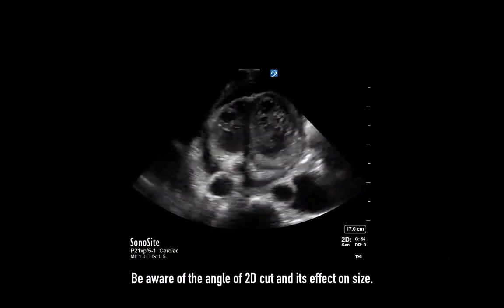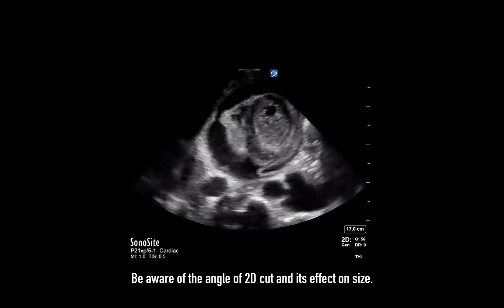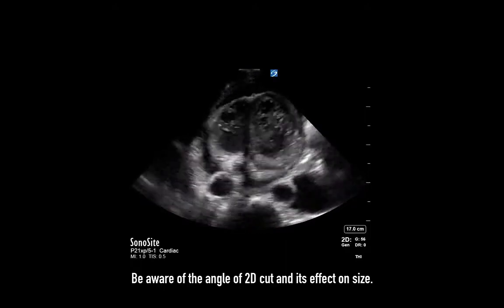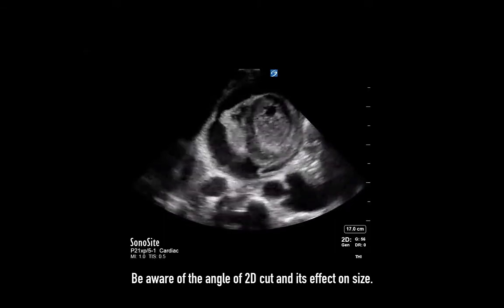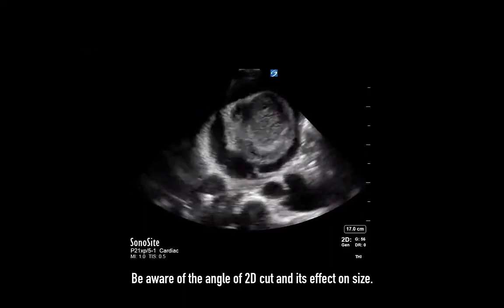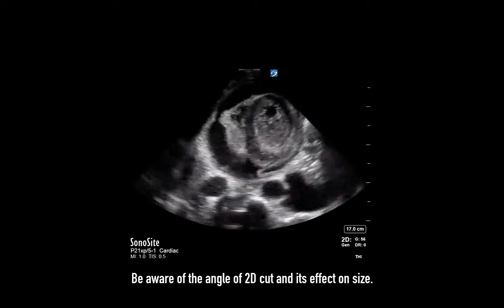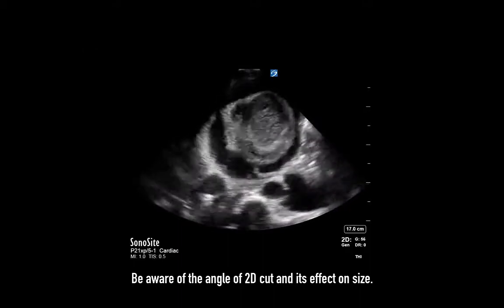The effusion size can also be overestimated as a result of the angle of the 2D cut through the planes. As you're going through closer to the apex, you can see the effusion looks huge, but that's just because you're cutting through a full slice of fluid instead of cutting through tissue. There are no specific standardization methods to measure effusions other than using multiple standard views, multiple measures, and clinical judgment. This is probably something that would be considered at least a moderate effusion.